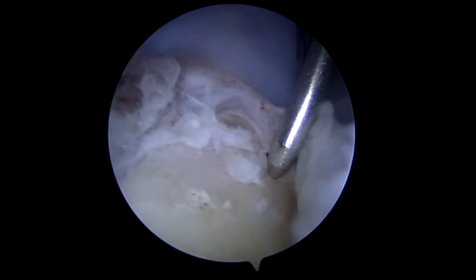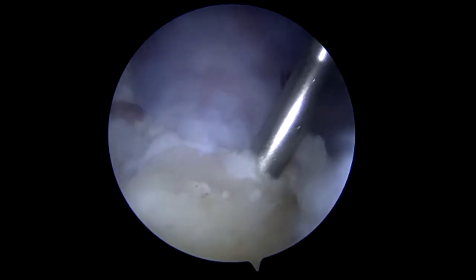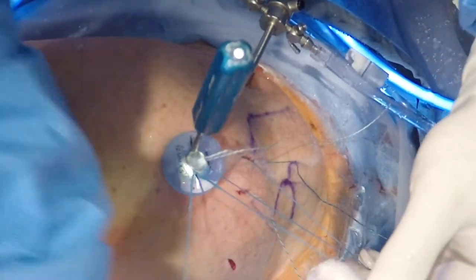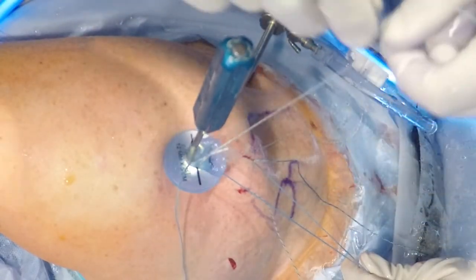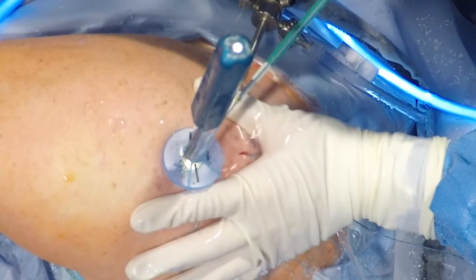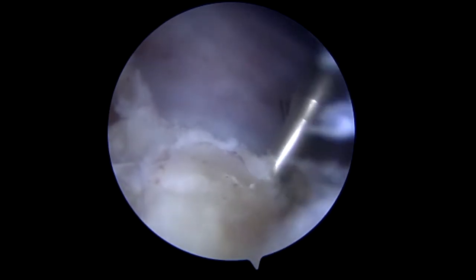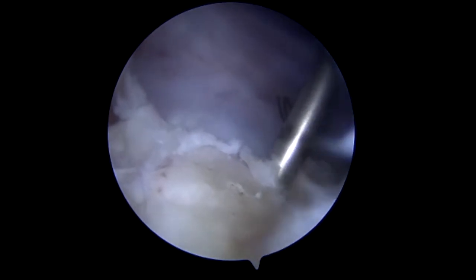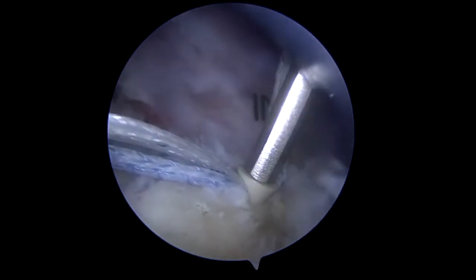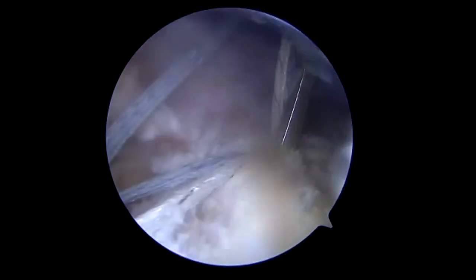We now move to creating the hole for the punch, which will be for the lateral row of the anchors in the tuberosity. Again, this was more challenging in this particular patient due to the previous anchors. These sutures will be crossed from the medial row — you can see there are two different color sutures because they are being crossed — which will give additional strength to the fixation of that graft.